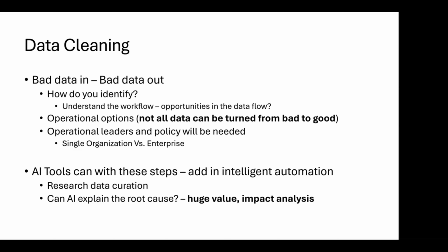A lot of times matching DICOM data to some other external source, the EMR. Nowadays we have FHIR, so you can get something and check real fast. There's a lot of ways to do it, but I would just offer, think through the data flow, the sources and destinations, and opportunities where you can have multiple checkpoints. You get the highest quality if you have that. There's also operational considerations. Not all data can be turned from bad to good. Like, do you need those QA systems for the CT scanner from 10 years ago that you decommissioned a few years ago?